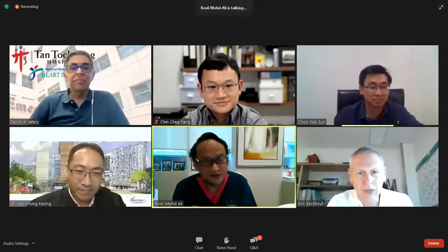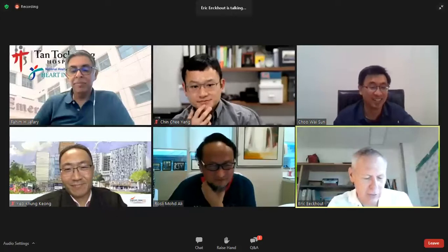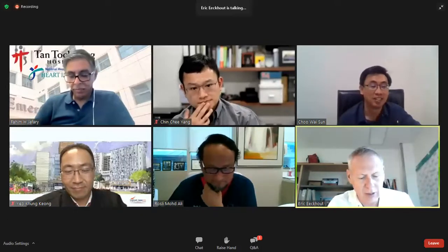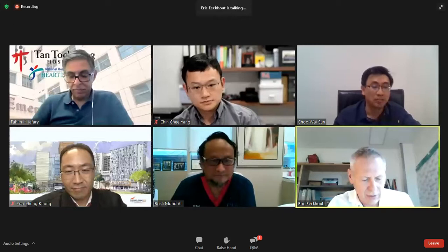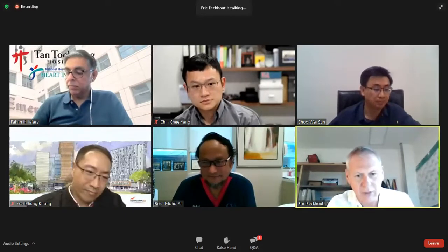Eric, the final word is yours. Last but not least, sorry. No, I think all has been said very wisely. I think we don't have to be diplomatic. I fully agree. But we all know that the majority of modern stents do well. There are indeed some stents, I fully agree, that maybe are not the right thing to choose. The advantage of Create is the marker, and once again, the fact that the stent is quite visible compared to some stents that are almost not visible.